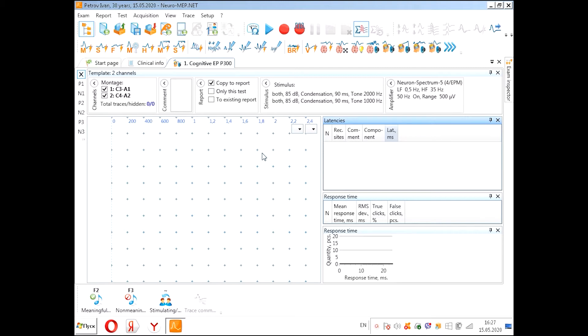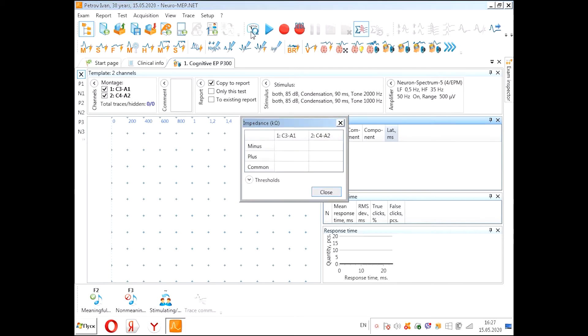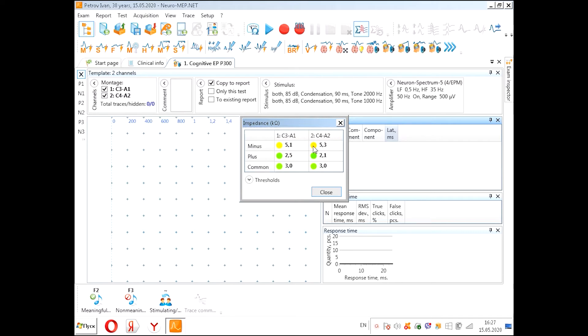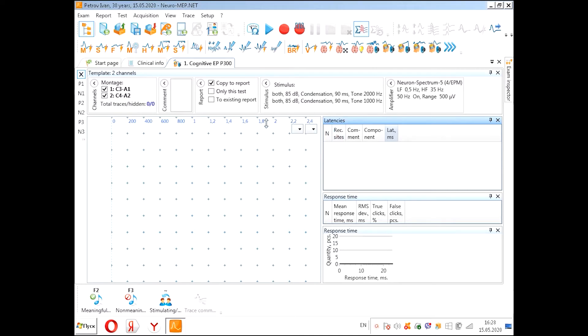Let's check the impedance. We see that the impedance is good enough. It will be ideal that the impedance will be in the border of 5 kilohms. Also we can check the impedance pressing the button on the device.